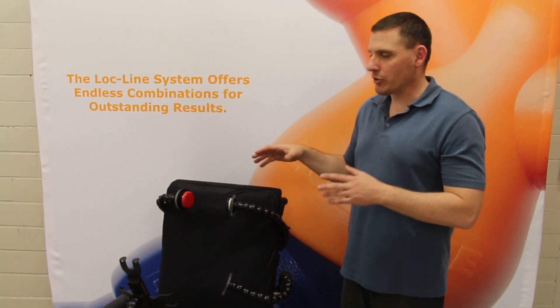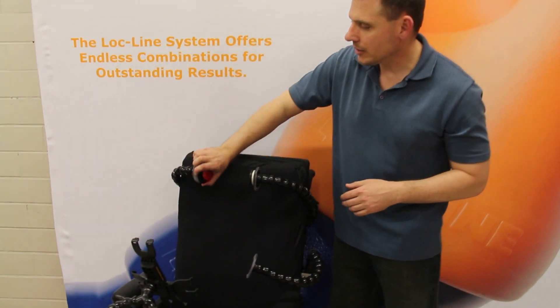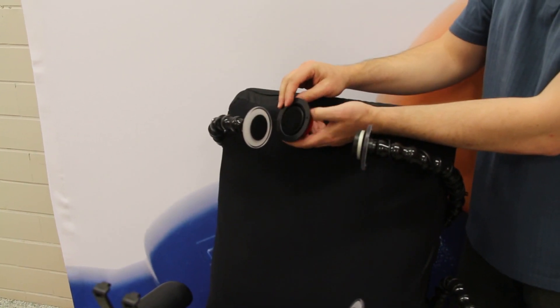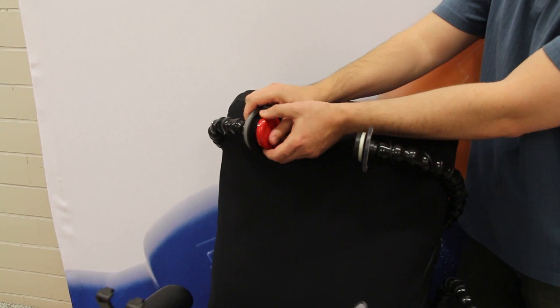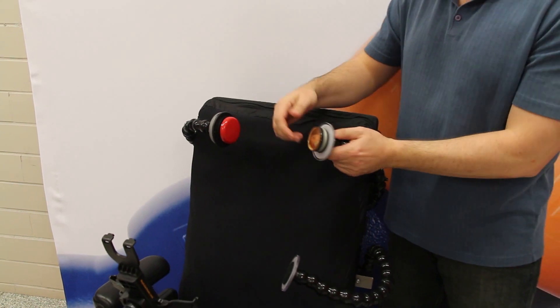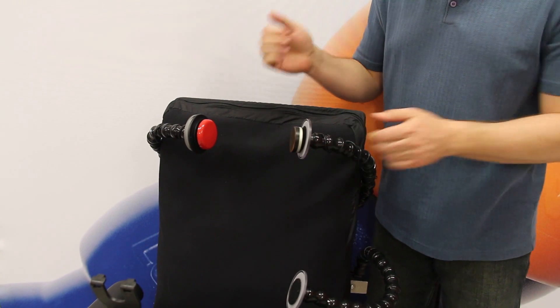We're demonstrating some common uses for the lockline in mounting applications. Very commonly, the lockline is used with this 3-inch disc. It comes with the Velcro circles, so you can use that to attach any type of switch. It works on a variety of different switches, so as long as you have a flat back on the switch, you can use any type of switch.